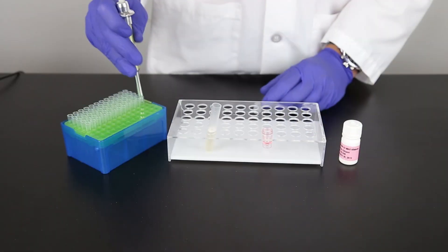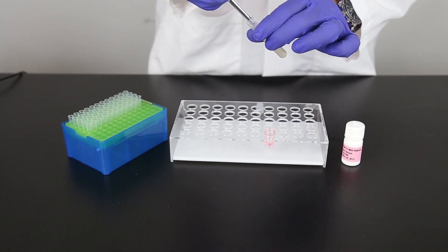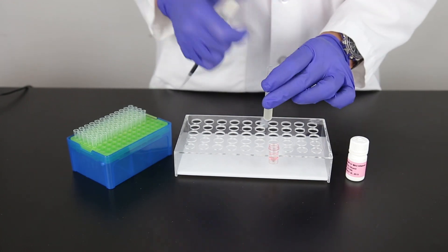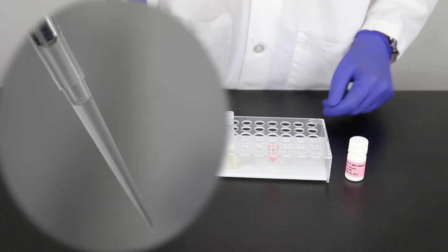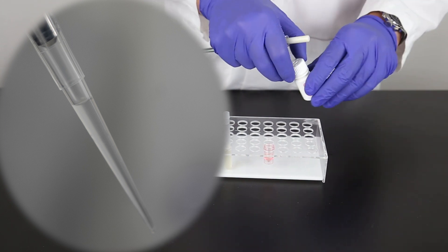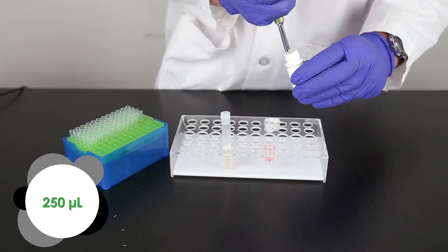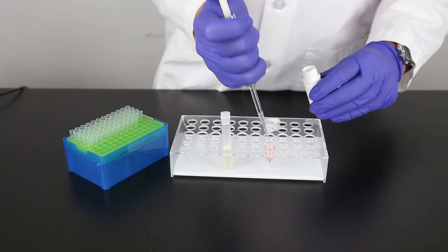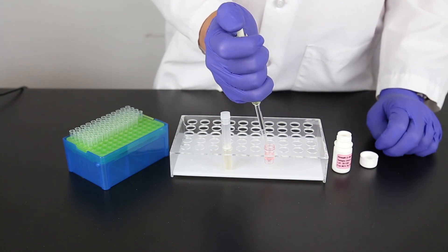For each sample you are testing, place a red dilution cup into the sample rack. Add 250 microliters of sample extract to the red dilution cup. It is important to make sure the pipette tip is fully charged with liquid and doesn't have any air bubbles prior to dispensing the liquid into the cup. Next, add 250 microliters of sample diluent to the sample cup. Mix by pipetting up and down five times. It is important to mix thoroughly.